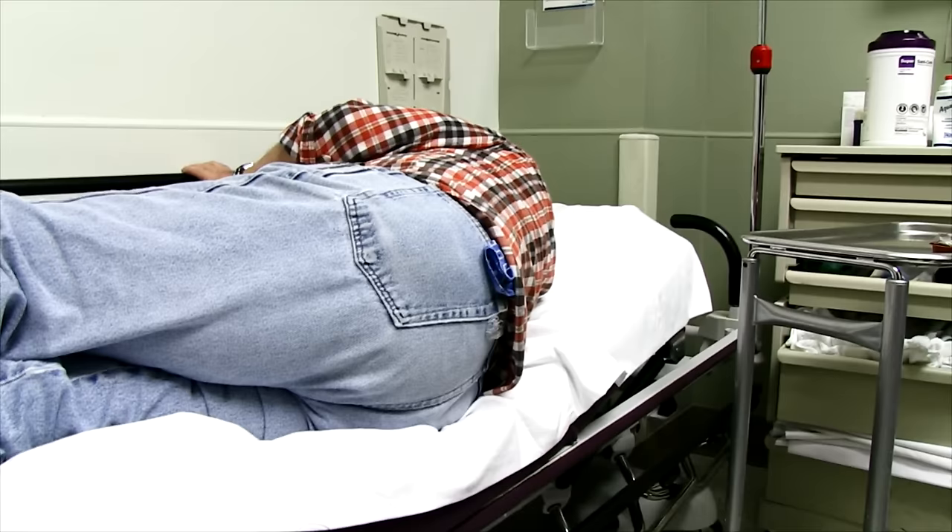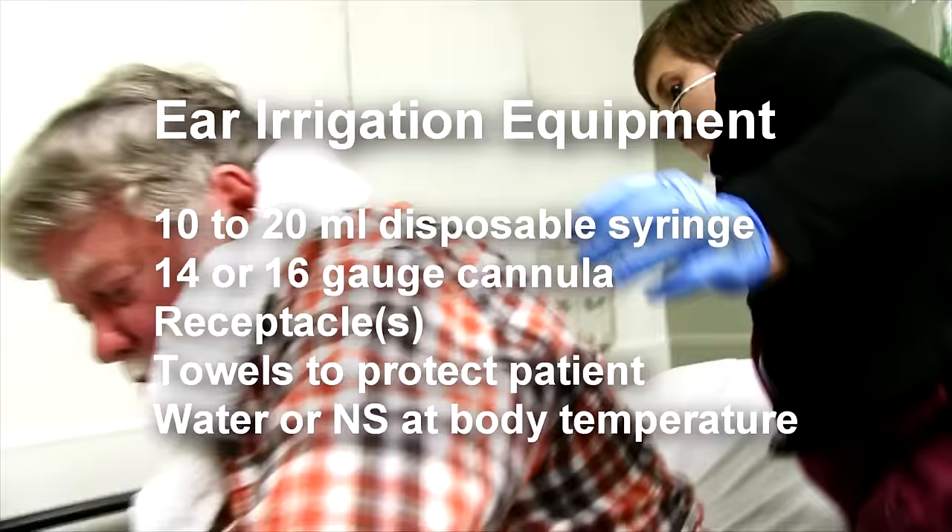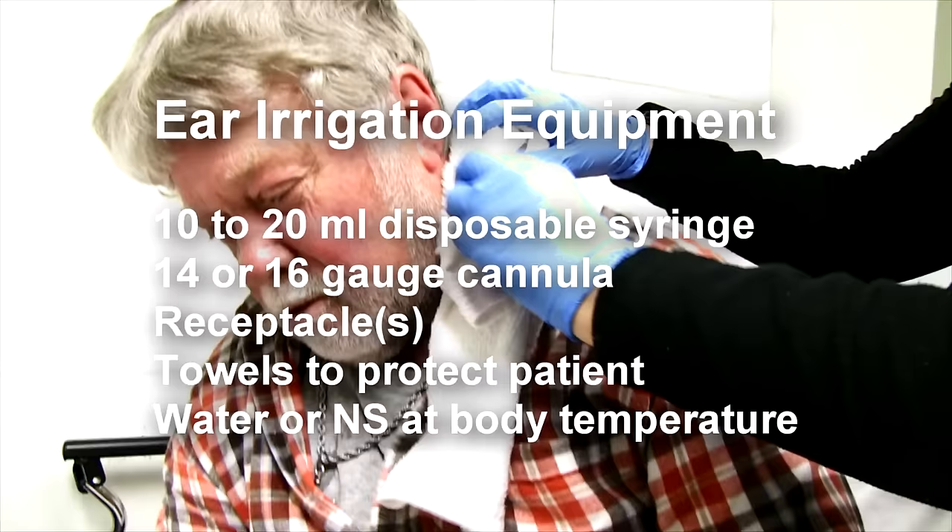Leah, do you find it's easier to irrigate with them laying down like that, or sitting up? I usually have them sit up. Okay, sitting up helps it drain out a little bit.